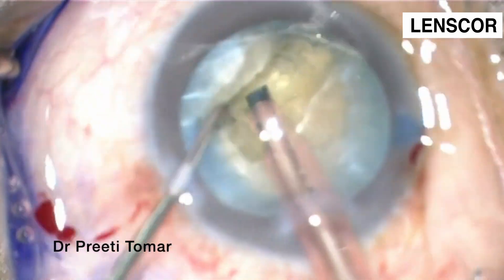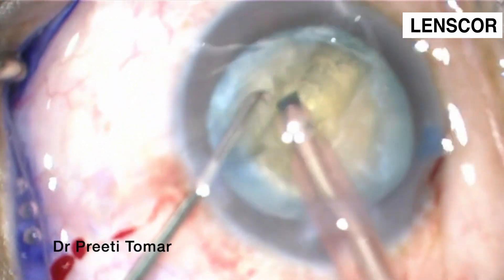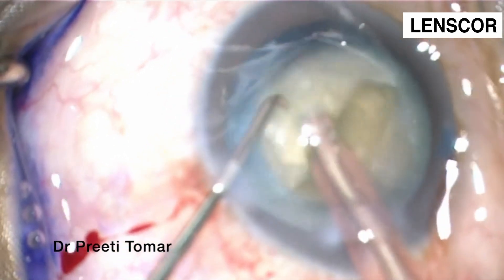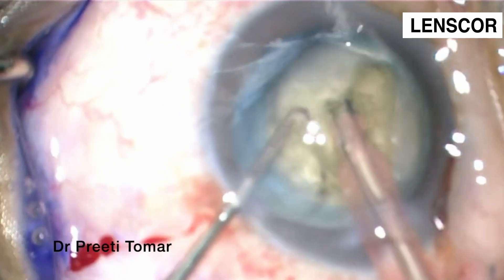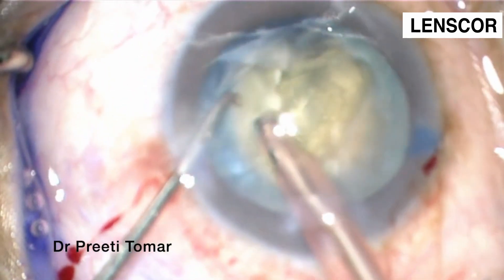We have completed our sculpting and divided the nucleus. Now we have stopped and started chopping — this is the stop and chop technique. We have divided the nucleus into two halves and now we begin chopping.